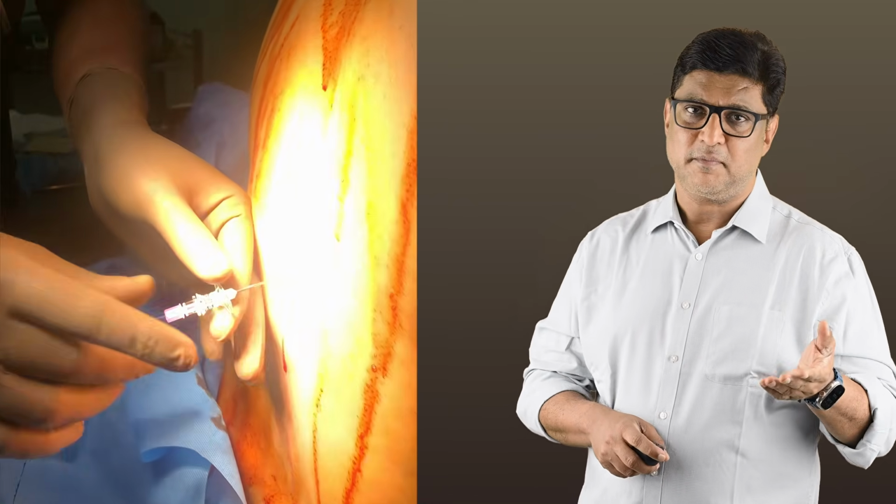So, from skin preparation to the loss of resistance techniques, this is the foundation for a safe and successful epidural block.